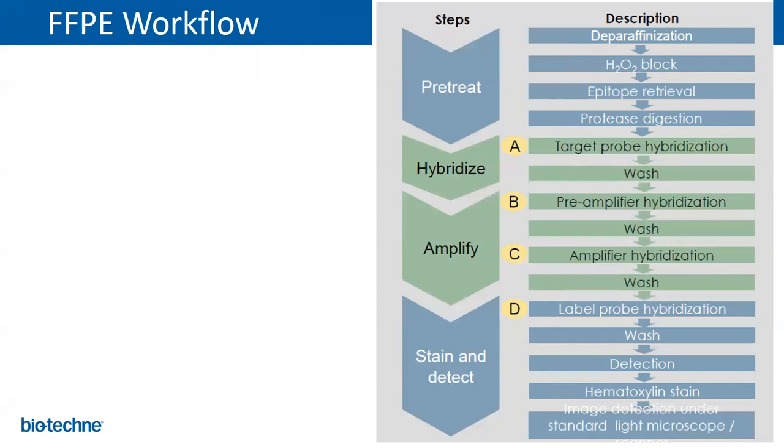Are there issues with RNA degradation from FFPE? Sure. Normally, sequencing of FFPE samples fragments anyway. But is the RNA basically still in the same location because it's fixed? Yeah, the question was, do you worry about FFPE affecting your ability to visualize the RNA and where it is in the tissue, given fragmentation? Not really. Fixation and FFPE preparation does fragment your RNA. But again, we just need 50 base pair chunks to be intact. And so as long as you have 6 pairs of RNAscope probes that are able to find chunks that they can hybridize to, you're going to get dots.